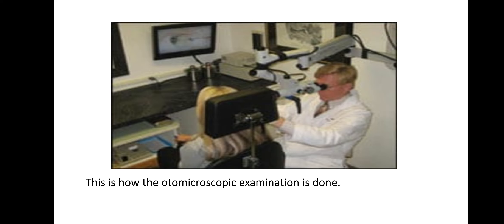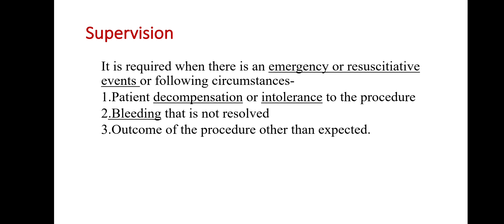This is the picture showing how otomicroscopic examination is performed. Supervision is required when there is an emergency or resuscitative events, or in the following circumstances: patient decompensation or intolerance to the procedure, bleeding that is not resolved, or outcome of the procedure other than expected. Thank you.